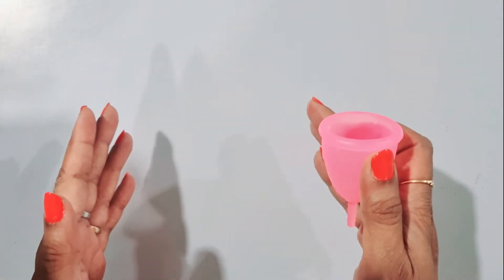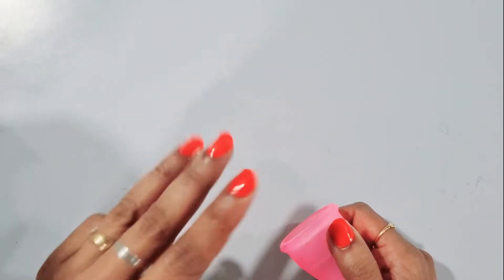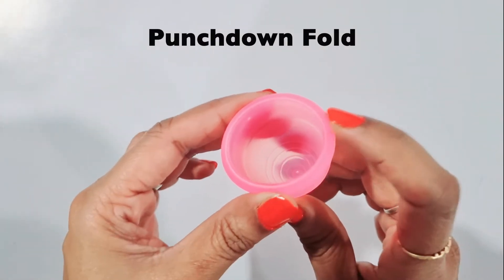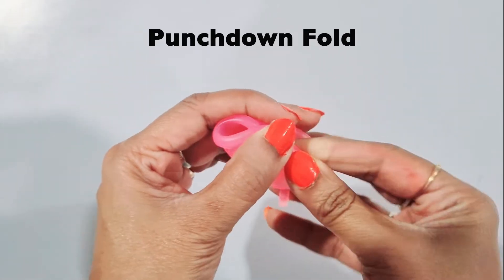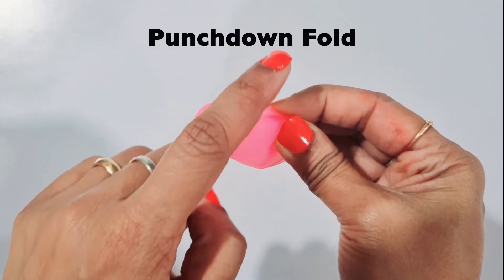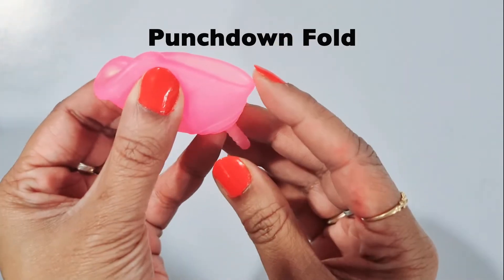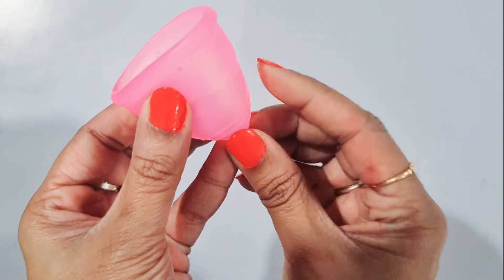While there are many techniques for inserting the cup, I will discuss three easiest folds suitable for all age groups. The first is the punch down fold. Here you push the top towards the inside as much as possible, fold it, and then insert it. This makes the area of insertion small and comfortable. Once inside, you can press on this point to form the seal.